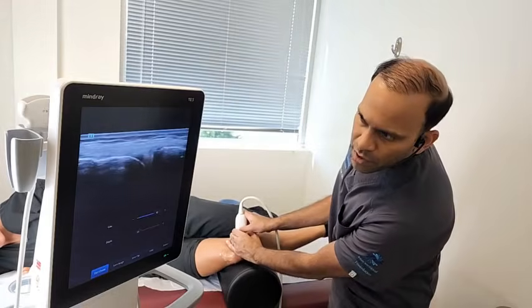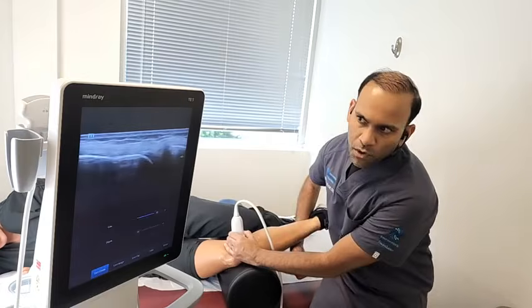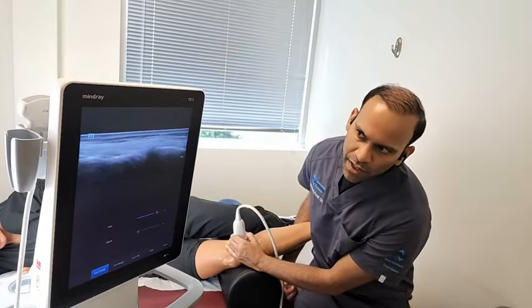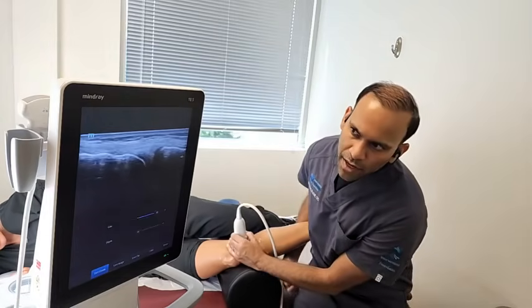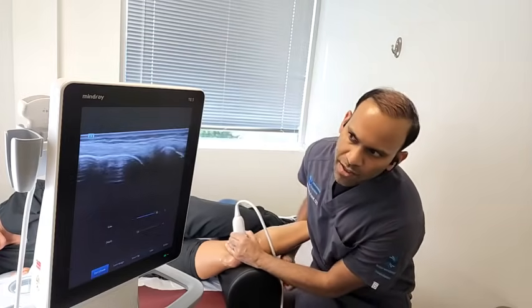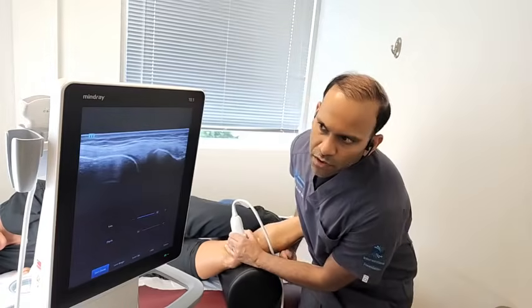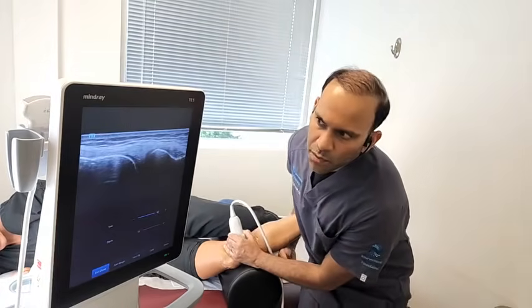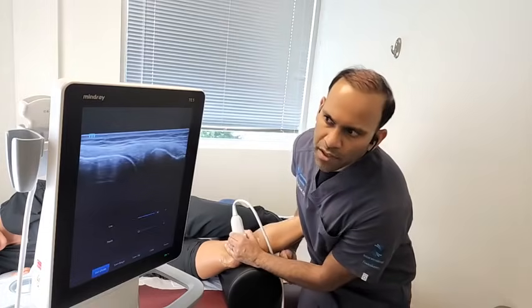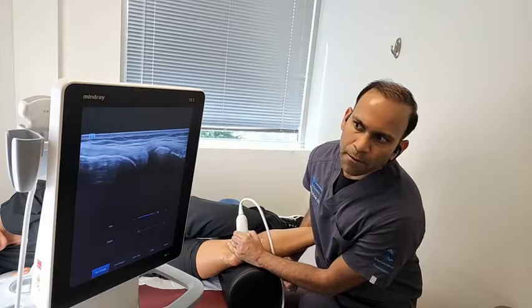So I'm going to try to do this, and I'm going to grab a hold of this leg and relax this leg nice and loose. And as I bring this knee into different positions, we can take a look and see how that meniscus is moving. So if you can picture this area between the two bones where that meniscus is that I identified before, you can see it kind of coming in and out as I move the knee.